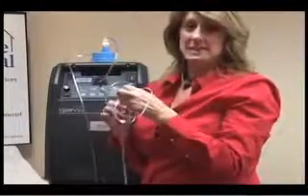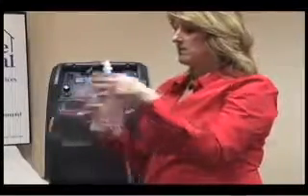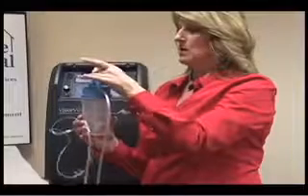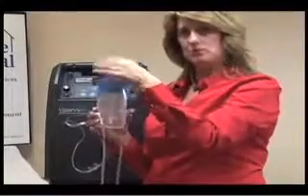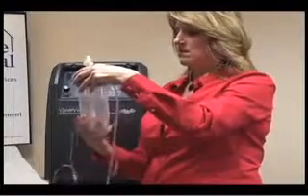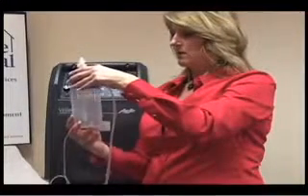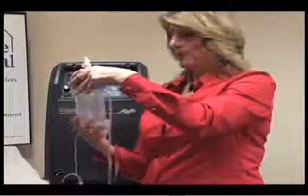Some troubleshooting techniques. When using a humidifier bottle, we need to remember that we need to thread the top on properly as well as the port that goes to the tubing to the concentrator. Make sure when taking the bottle off to replace your water or cleaning, you make it go flush on top and turn.